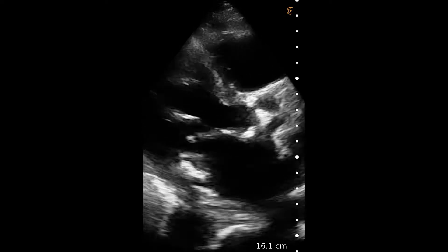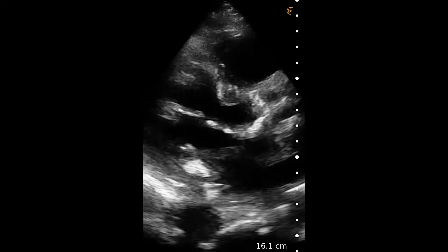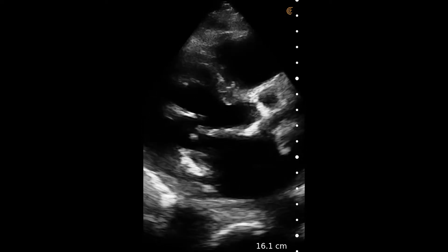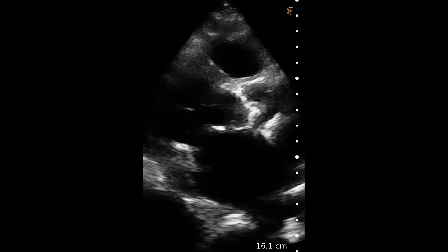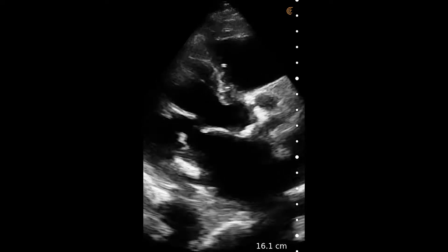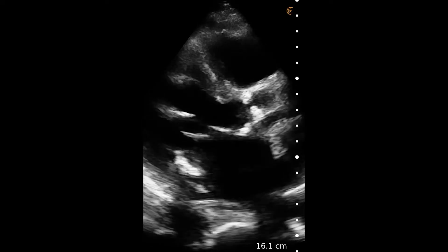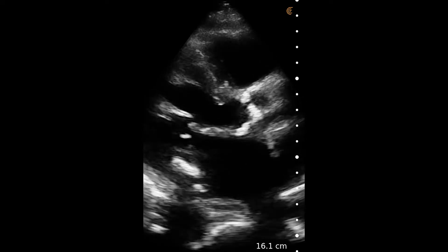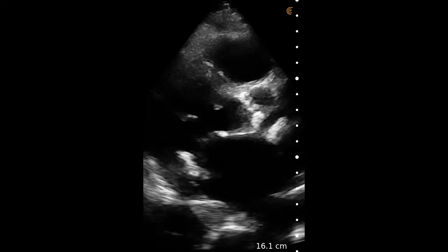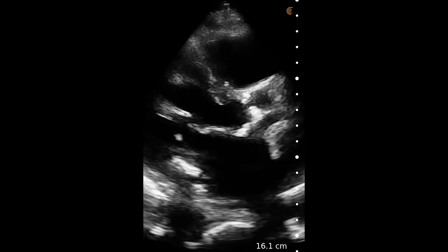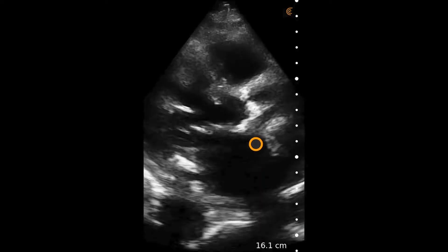In this video, we see the phased array scanner on a cardiac preset placed roughly in a parasternal long axis view on the patient's left chest. This was a somewhat technically challenging scan. This patient presented with fatigue and shortness of breath on exertion.